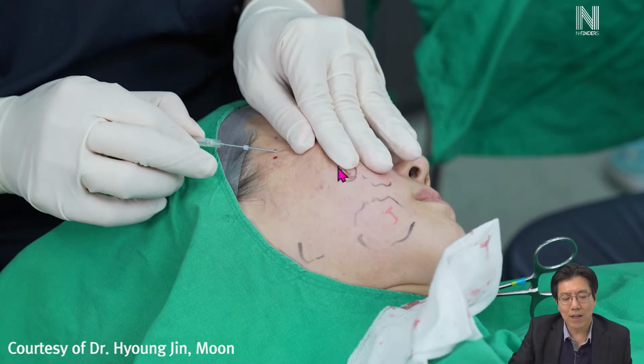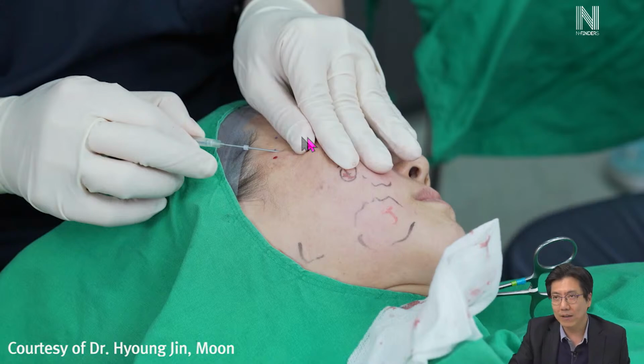For the Asian, we do not like a high malar bone. As you see, my thumb is exactly located on the infraorbital fat area, the malar area. The reason why I do not want to lift up this area is that if I lift this area, probably my patient will kill me. This is not good in face lifting in Asia. So I do not want to make some volume on the malar area. So I fix this area with my thumb and I just lift this nasal fat compartment.